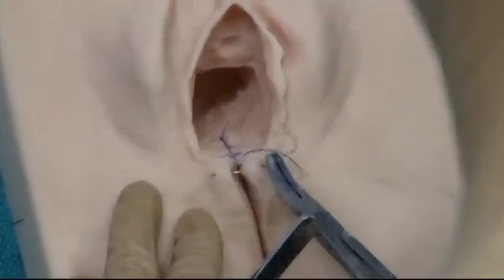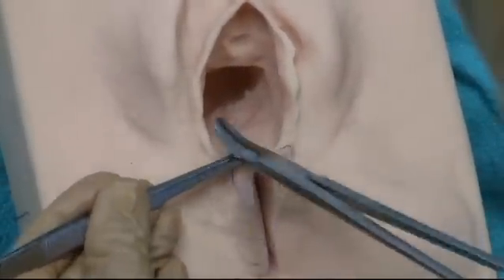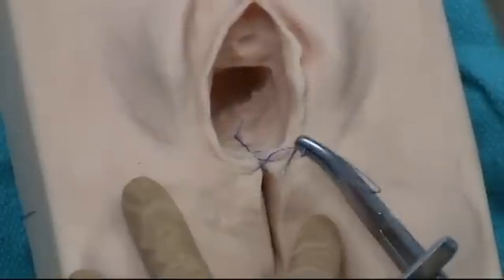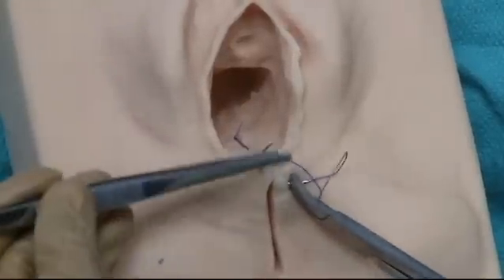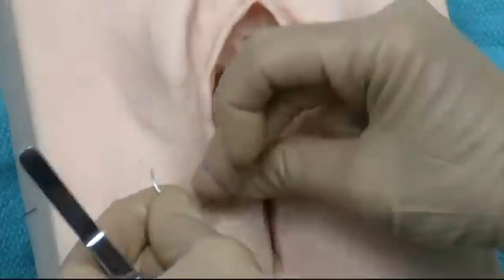I'm told — although I have not read — that putting the suture material through the hymenal ring causes more dyspareunia. So here I'm just going to take one more stitch just on the perineal tissue, and then we're going to do a sliding slip knot because that actually decreases the amount of suture material that we'll be tying to later.